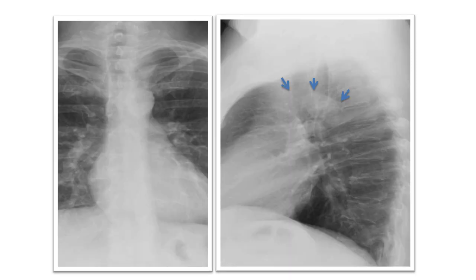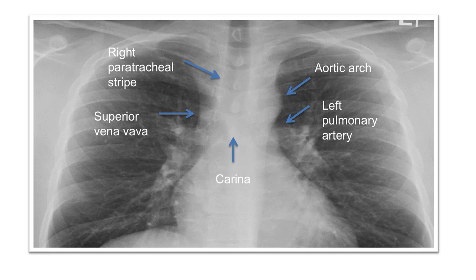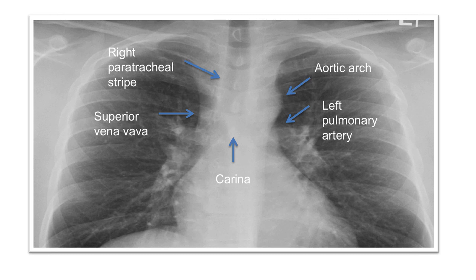The aortic arch can also be seen on the lateral x-ray as a white arch coursing from front to back. Because of its shape and gray scale, the trachea can be easily identified on the chest x-ray. We can now use the trachea as a landmark to learn about and to identify other anatomical structures such as the carina, the superior vena cava, the right paratracheal stripe, the aortic arch, and the left pulmonary artery — all anatomical structures that we will be discussing in future videos.